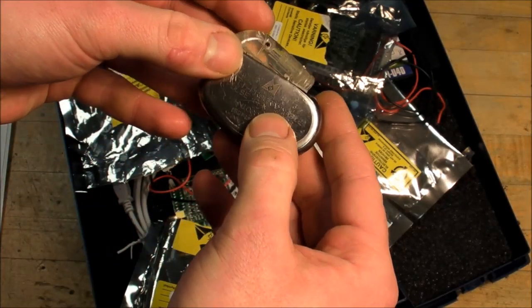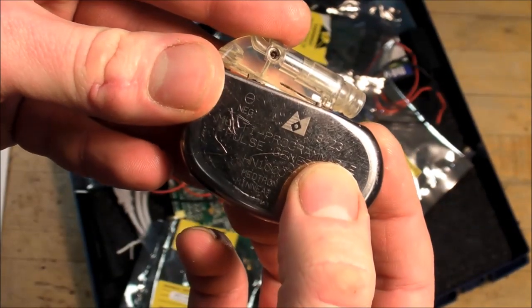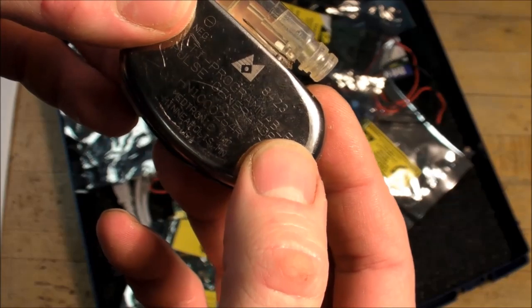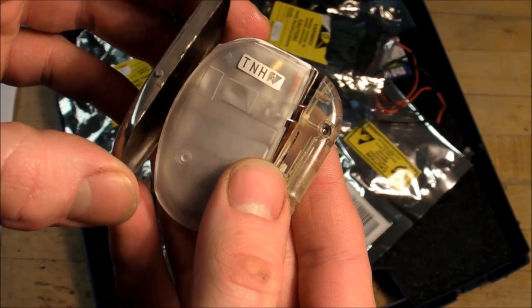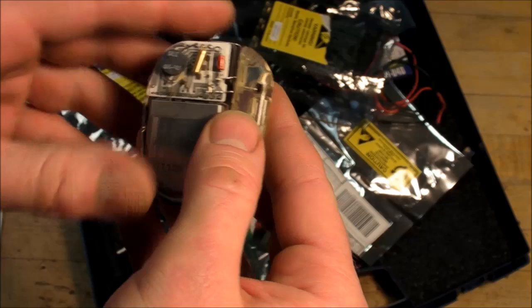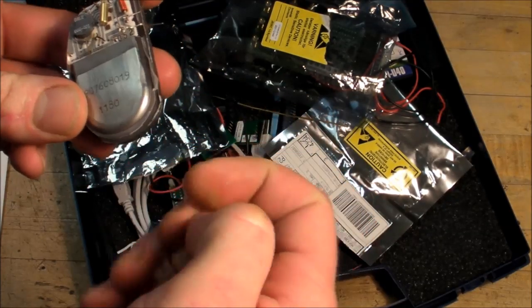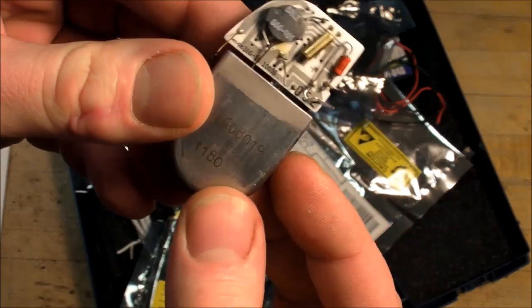So this one, you can see the date code here, 23rd week of 1984. So I'm not sure if this actually had any communication possibilities, because the technology in here is much simpler than the defibrillator that Mike took apart. But basically, it really only has one single connection going out to the heart, just one single wire to create the pulse for the heart. And that's basically what it looks like.